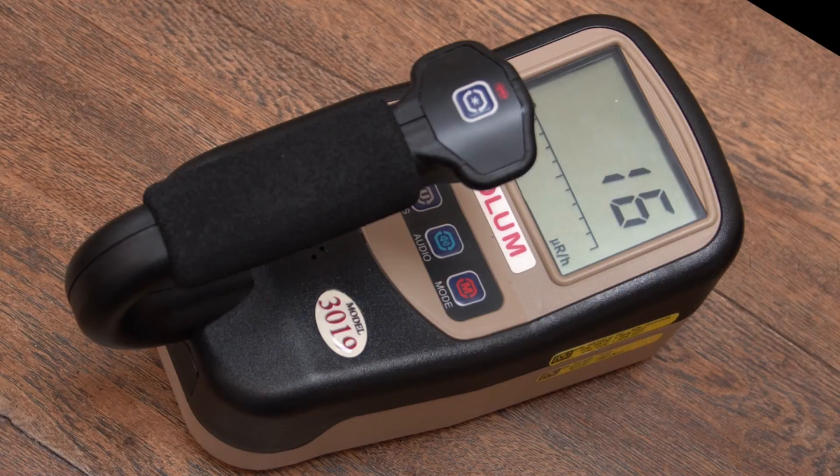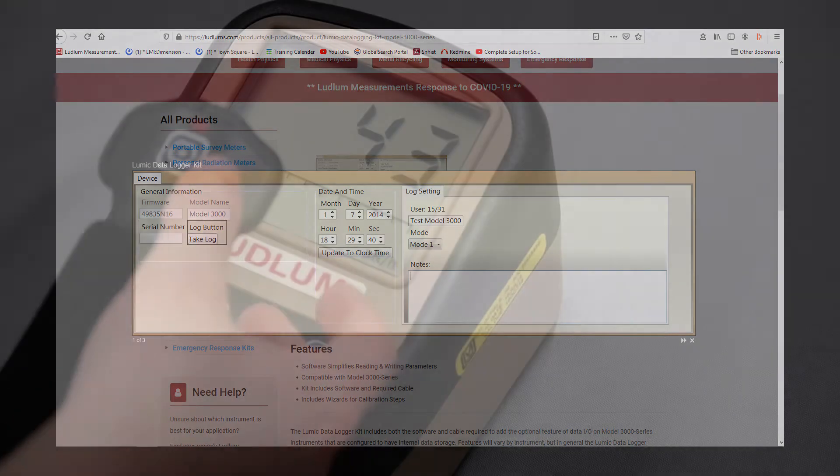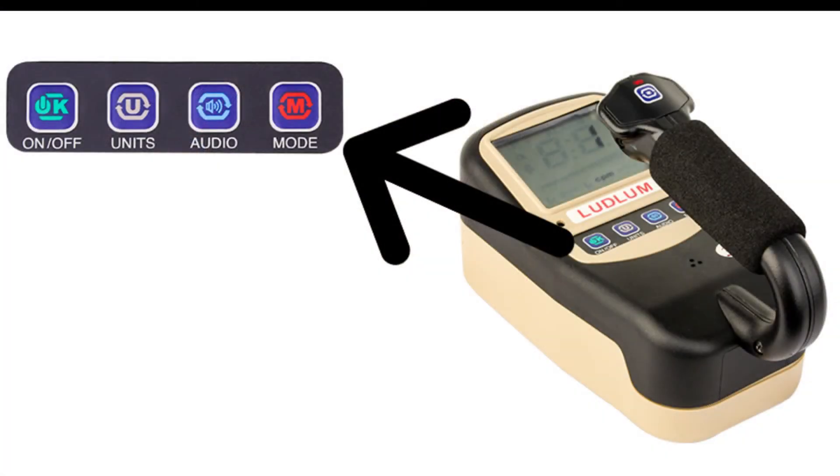The Model 3019 has the ability to log measurements to memory for later download. The optional Ludlum Lumic data log software is needed to download this memory. The unit can log up to 1,000 measurements.